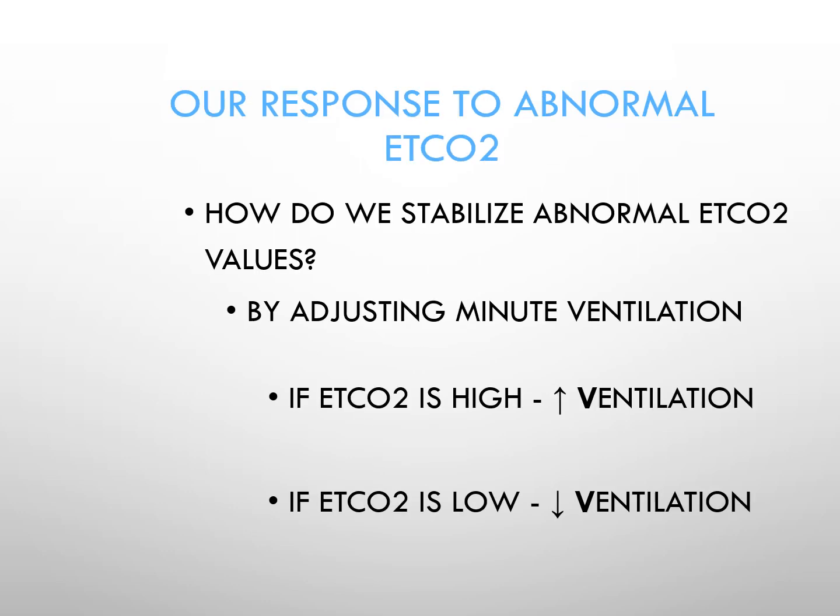The question arises, broadly speaking, how do you respond to an abnormal CO2? This comes up clinically, and it comes up with our credentialing exam candidates. For instance, if you have an end-tidal CO2 and you have reason to believe that it's accurate, it's been correlated to a PaCO2 via a blood gas. If you have an end-tidal CO2 that's high, you need to increase ventilation. If you have an end-tidal CO2 that's low, you need to decrease ventilation.